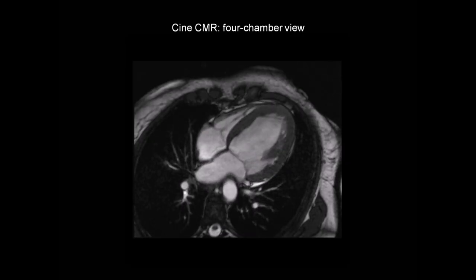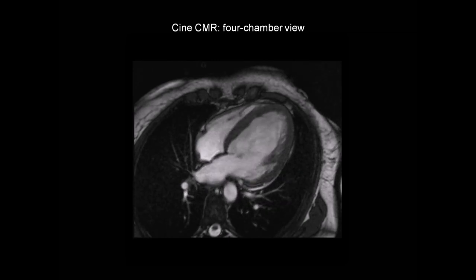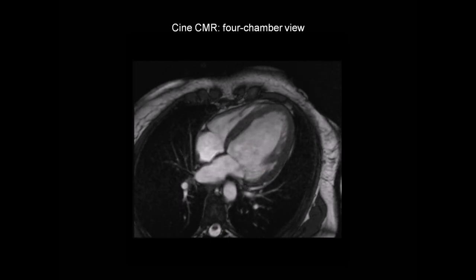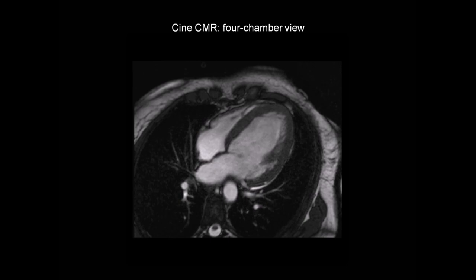This is a 48-year-old female patient who presented with clinical features compatible with myocarditis. This is her cine-CMR image from the four-chamber view. We have the left ventricle, left atrium, right ventricle, and right atrium. What is notable is that the left ventricle is dilated and severely impaired — her left ventricular ejection fraction was just 20%. So she has severely impaired left ventricular systolic function, which is one of the supportive pieces of evidence for a diagnosis of myocarditis.